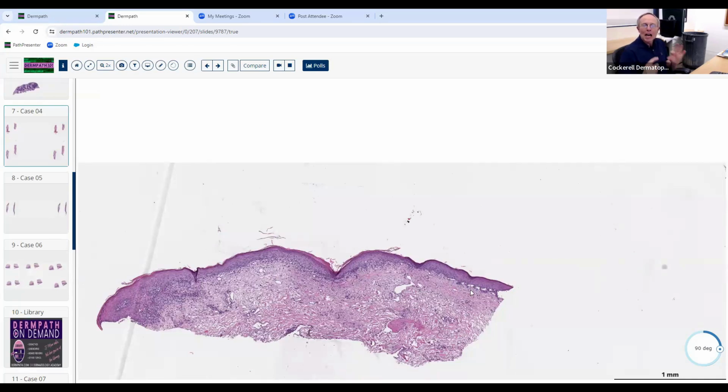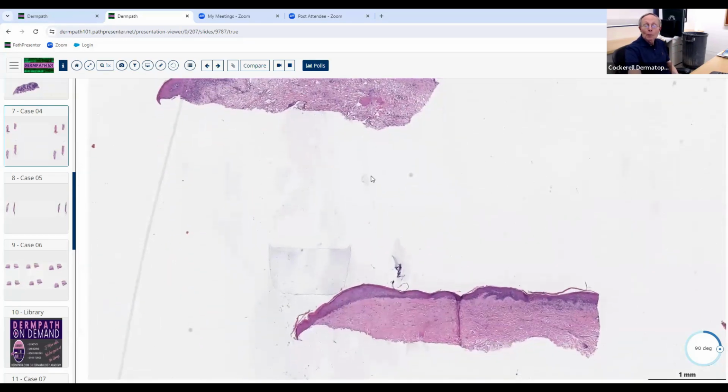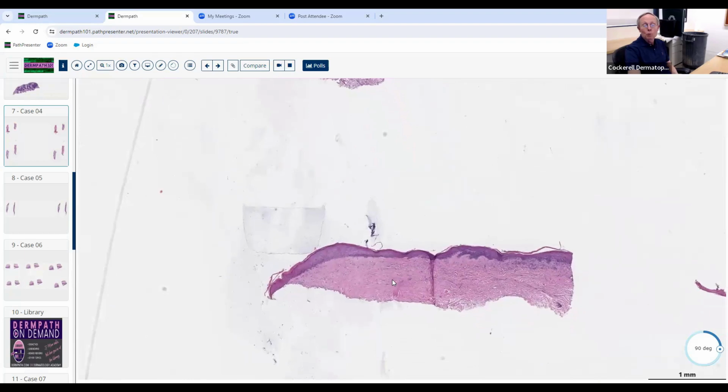So it's fairly non-specific. So if you just had this alone, you wouldn't say graft versus host disease, you'd put it in the differential. But when you couple these together, and this is probably, they wouldn't just give you this on the board examination, I think, without some clues to kind of guide you in this general direction. This would be on a scale of 1 to 10, about a 9 on difficulty without really any history. But at least you've seen it now and you've heard of it, and I want you to think about it.